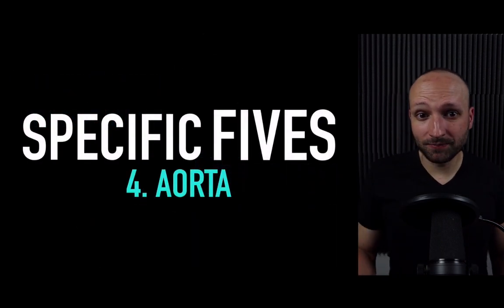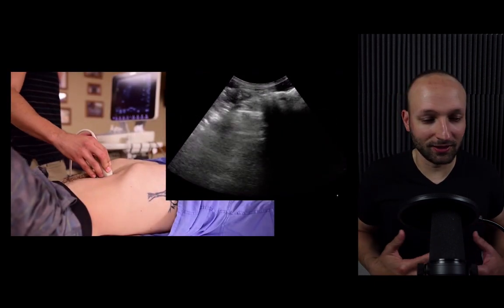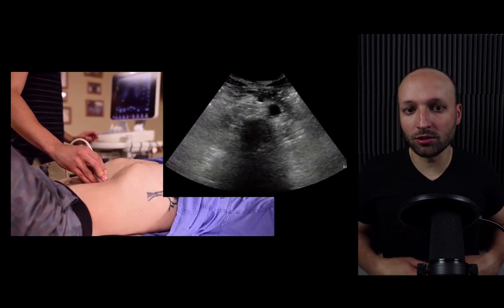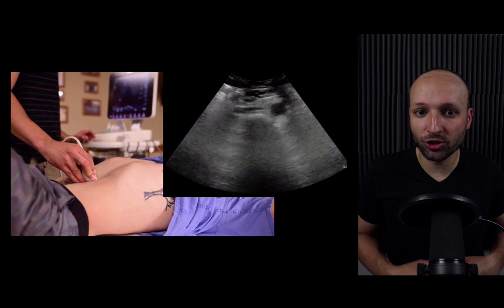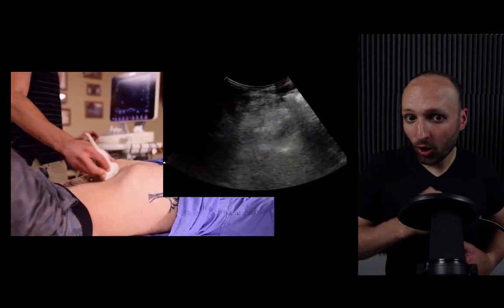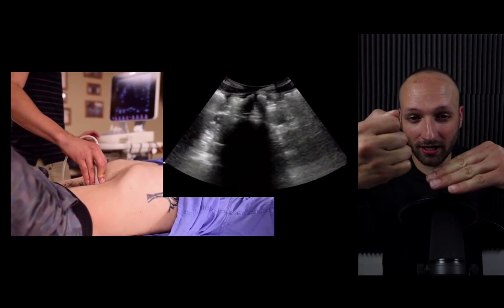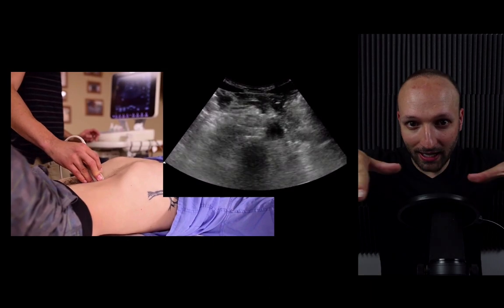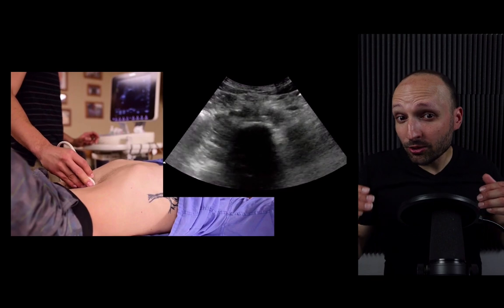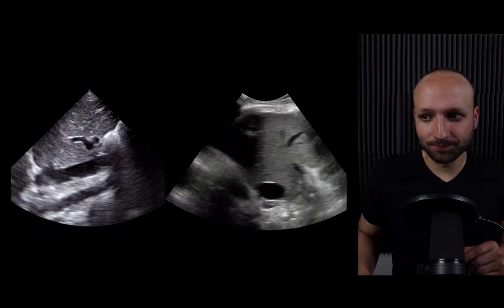With the aorta, this can be a little bit difficult with a lot of my patients because they have a lot of bowel gas. You can push harder. This is one of those examinations where you will be surprised how much pressure you can apply before you actually cause any discomfort whatsoever. I hold down pressure and just wait for that bowel to peristalse out of the way. Sometimes I'll even use my other hand to create a higher surface area so that bowel can get out of the way. Make sure you decrease your depth as well, just to get better visualization of that aorta.